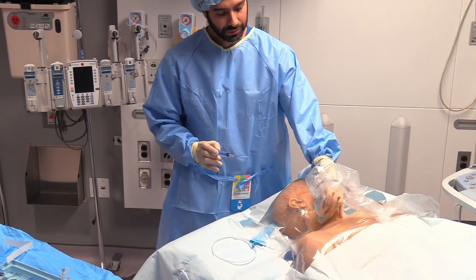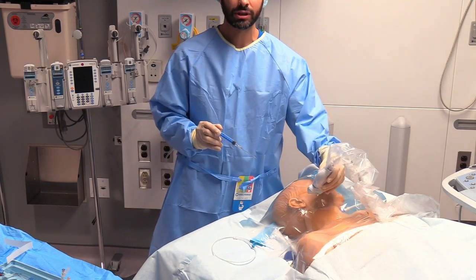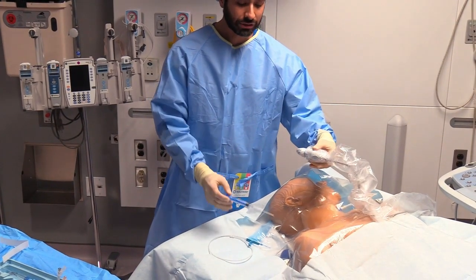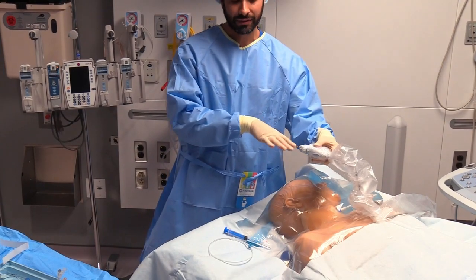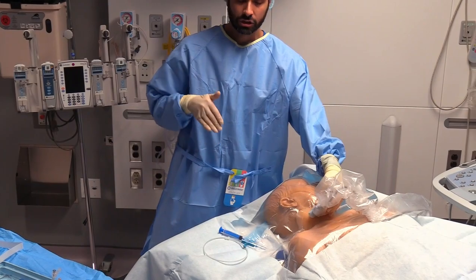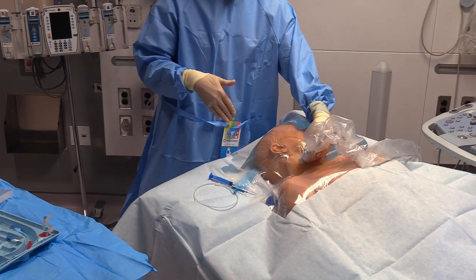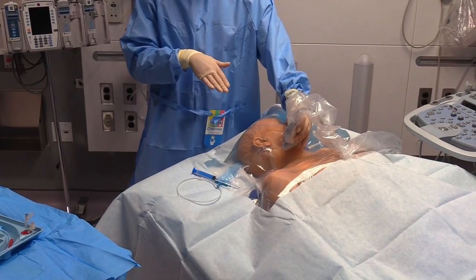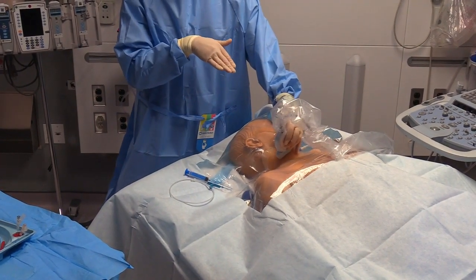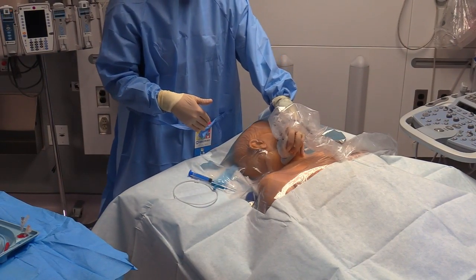One of the things that you want to do with the ultrasound is make sure that it's perpendicular to the vein. A lot of times people will have the ultrasound placed and tilted. The ultrasound is just shooting two-dimensional rays that are coming out of it. So if the ultrasound is tilted this way, it'll be pointing towards the patient's head. So by the time that your needle reaches the patient, it may have already gone past where the ultrasound is. So it's nice to imagine where the vein is in the patient and have the ultrasound be perpendicular to that point. So I've got the ultrasound here kind of pointing perpendicular directly to where I think the vein is.